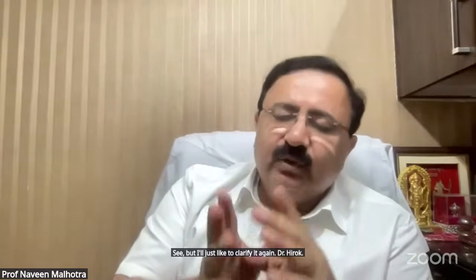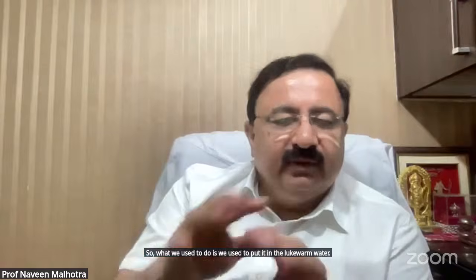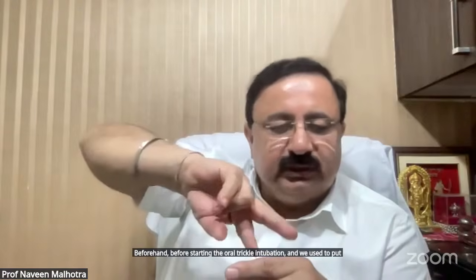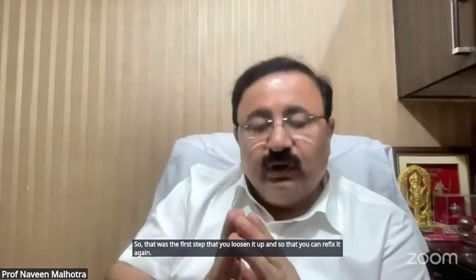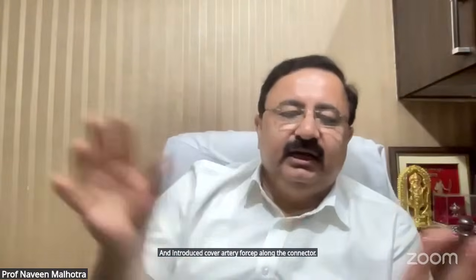I'd just like to clarify it again, Dr. Hiru. In the earlier days, the connector was not removable, but with the advent of the PVC tube, it was fixed with a glue. So what we used to do is put it in lukewarm water beforehand, before starting the orotracheal intubation, and put a curved artery forceps along its connector to loosen it up. So that was the first step, that you loosen it up so that you can refix it again. If the connector is not removable, the incision becomes very big. So nowadays there are absolutely no worries. Put it in lukewarm water and introduce the curved artery forceps along the connector. It can be easily detached.